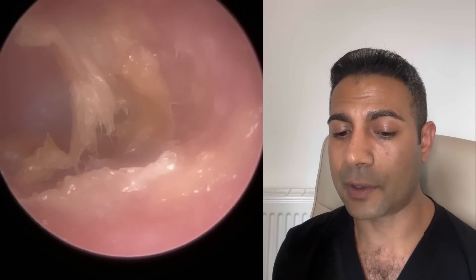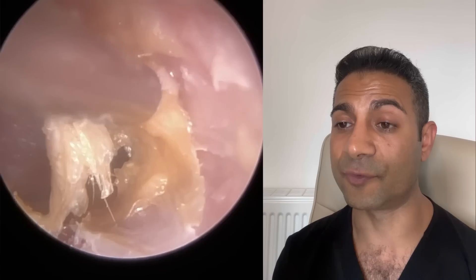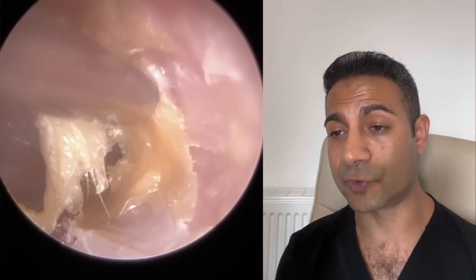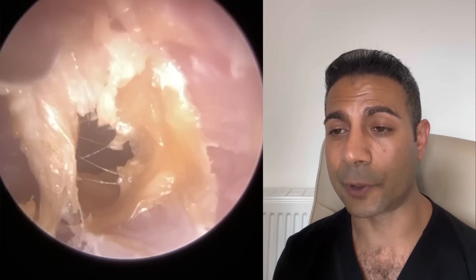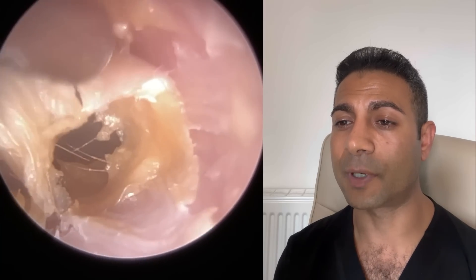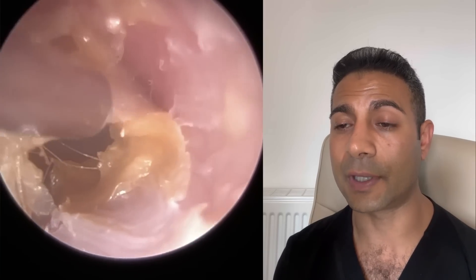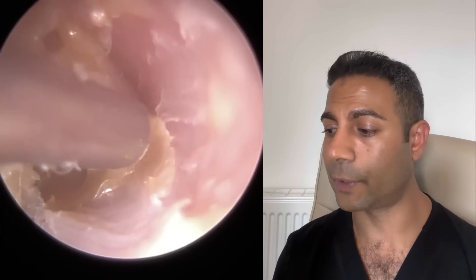For patient comfort, I don't really like using anything larger than a zolnir suction probe. It may generate too much negative pressure in the ear and cause the eardrum itself to displace and move laterally towards the entrance, which we don't want. I've never heard of any instances where a patient has suffered physical trauma to the eardrum due to the negative suction power, but there is the potential if you apply too much suction in the ear. So that's the overview of the zolnir suction probe.